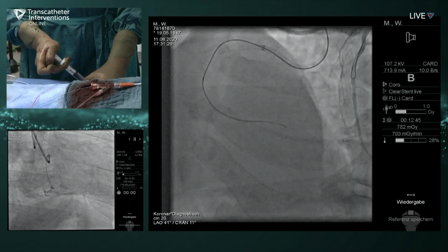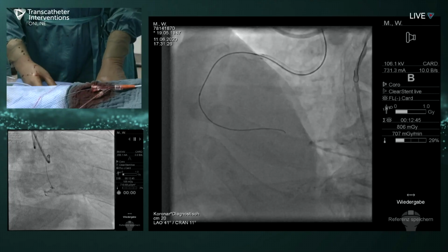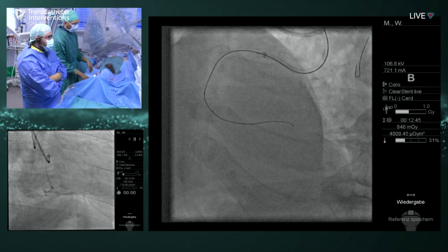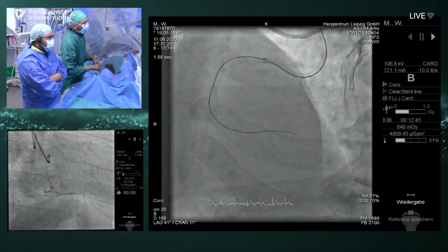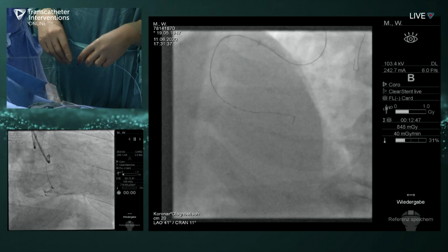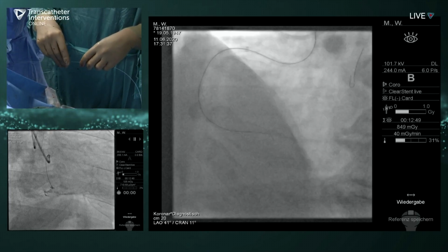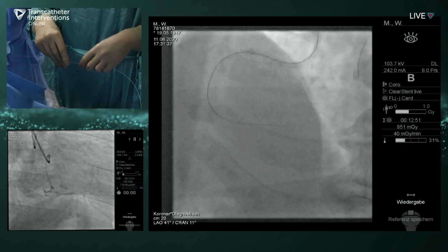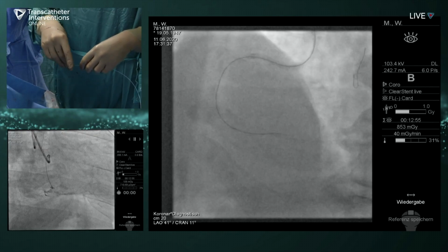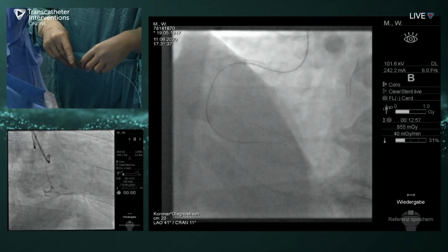It's a good question though, because with some of the newer dual lumen catheters like the Sasuke, it has a low profile and it's pretty good, and that might be a way to ensure that you are going, or at least starting, parallel. We don't use parallel wire technique very much, but I think if you were going to do it, that would be the way.